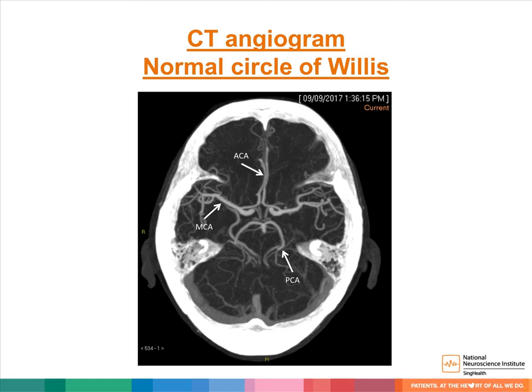Now we move on to CT angiograms. This is an example of a normal CT angiogram showing the Circle of Willis. We can see bilateral middle cerebral arteries directed horizontally. The anterior cerebral arteries are directed anteriorly, and the posterior cerebral arteries are directed posteriorly.